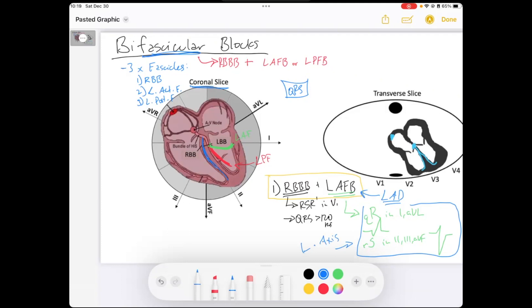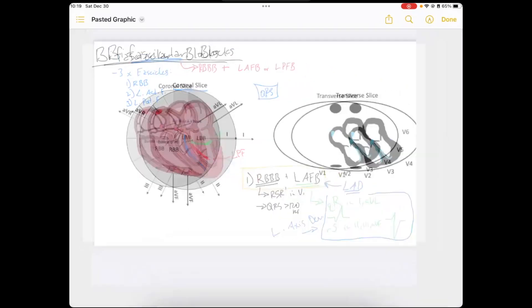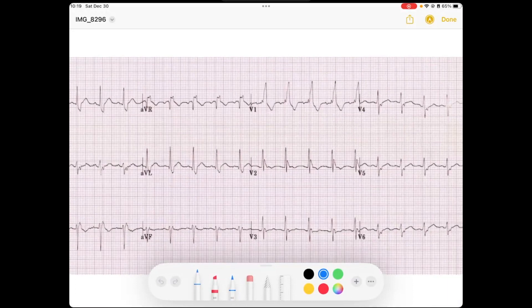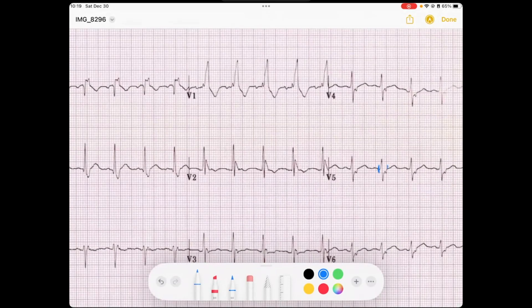So this first type of bifascicular block shows a right bundle branch block pattern — the RSR prime in V1 — and left axis deviation created by the left anterior fascicular block. Let's take a look at what an EKG might look like. In this case, we've got a widened QRS. Looking at the QRS duration in V5, it's greater than 120 milliseconds, so it's wide.